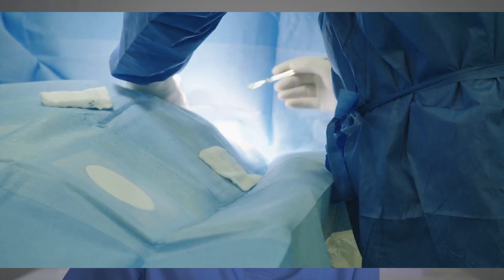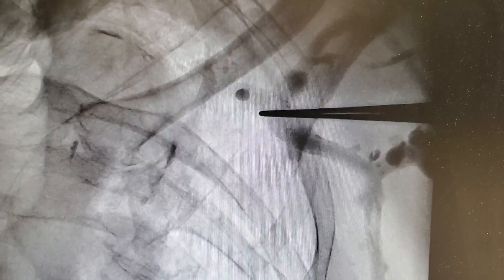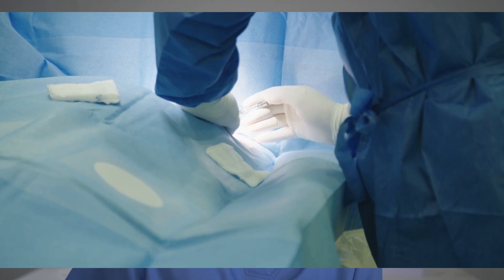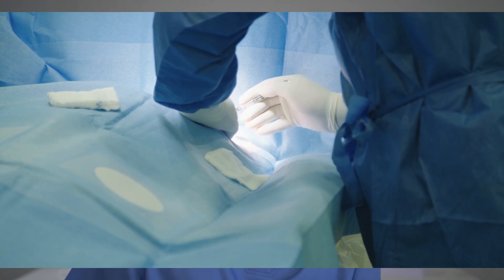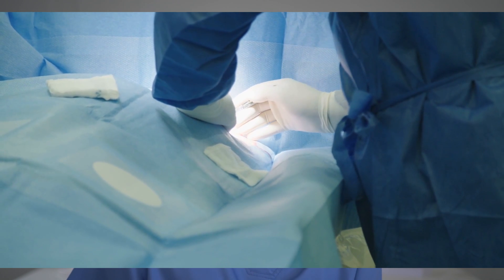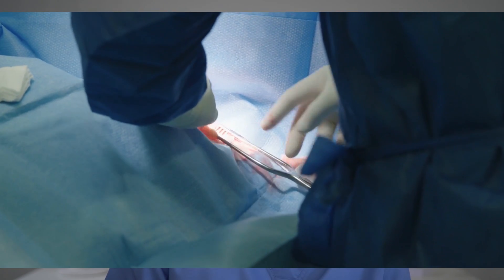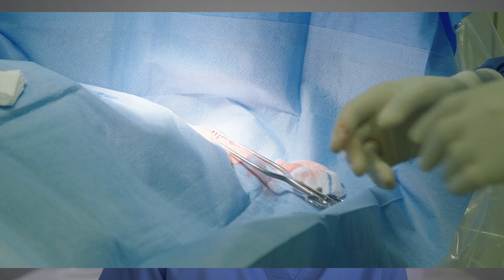As you can see, first the patient is brought to the operating room. Initially, a contrast is sometimes injected to visualize the subclavian and axillary veins as shown here. Then the cardiologist performs a skin incision in the chest under the collar bone. The skin incision is then deepened and kept open using a retractor. Then the cardiologist gets access to a large vein, generally the subclavian vein, using a needle.